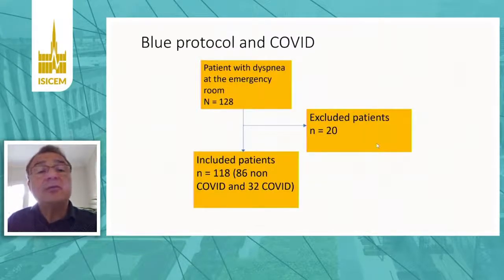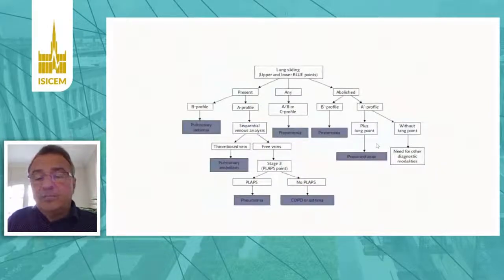But the problem is that we were faced with the COVID-19 epidemic, and we would like to verify that we may still use the Blue Protocol in patients with dyspnea at the emergency room during this period with COVID-19 patients. And then we included in this study 118 patients, 86 non-COVID and 32 COVID patients, and we analyzed the accuracy of the Blue Protocol. And of course, we used the original Blue Protocol for that.